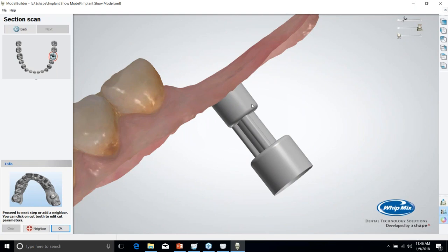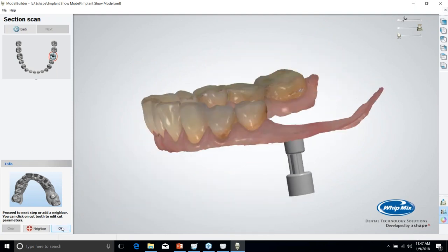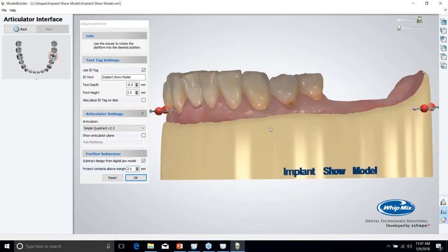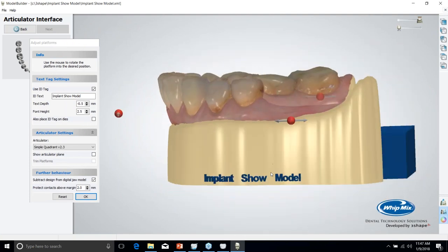When it's printed out, it's going to have this channel in it. You place your two-piece analog in, screw it together, and then you've got your working model for the lab. So there's not really anything I do here as far as sectioning the scan. You're not going to adjust the insertion direction, so I'll just hit OK. Your implant models will, especially if they're going to have analogs in them, be taller than what you're used to because it has to accommodate the full height of that analog.